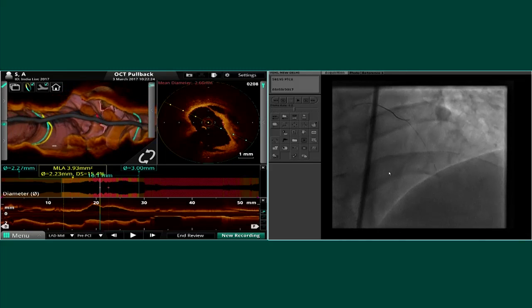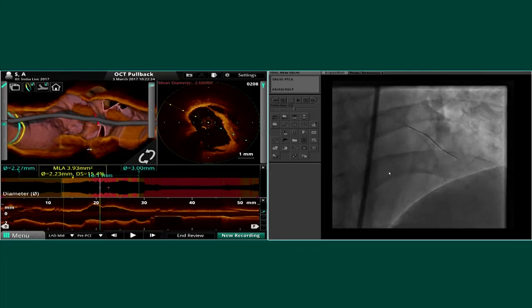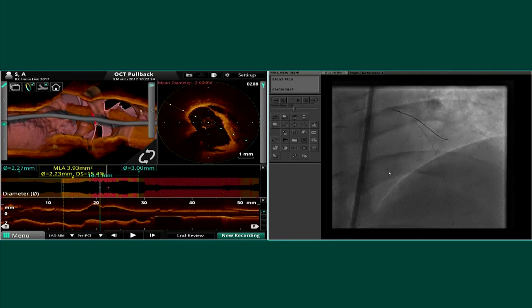We are seeing the three-dimensional reconstructions are interesting, but still we have to try to understand the dissection flaps we see on the cross-sectional and to be sure that we're looking at the bifurcation and find the proximal landing zone.